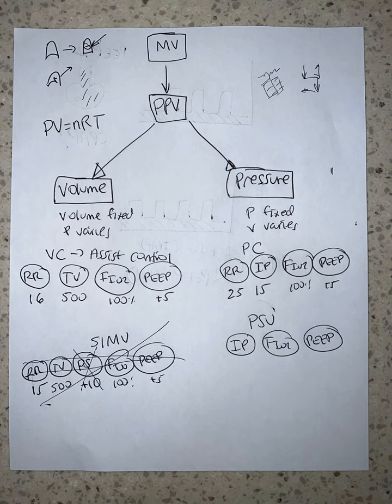Mechanical ventilation is different than how Darth Vader breathes. Darth Vader breathes with a negative pressure ventilator. I don't know if everybody knows that. Outside of his chest, it creates a vacuum that expands the lungs, opens and closes. There are some negative pressure ventilators on the market now. That is how Darth Vader breathes, and that's kind of how we breathe.